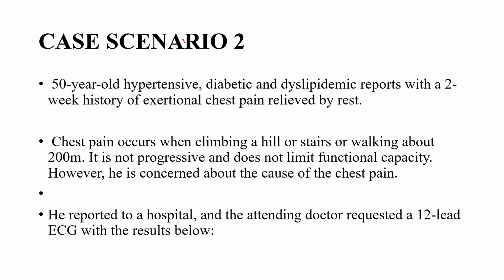So if you evaluate with a stress test and the patient fulfills the criteria of developing a gradient of greater than 15 with pulmonary pressures going above 60, then it means that the mitral valve stenosis is significant and requires surgical intervention. So in situations where it is ambiguous, you can use the dobutamine stress test, provided there's no contraindication.